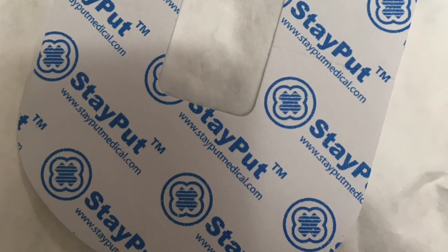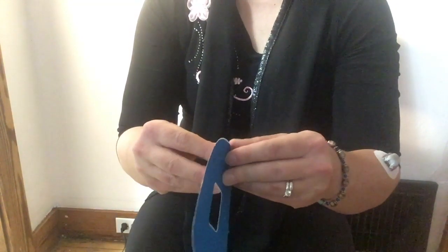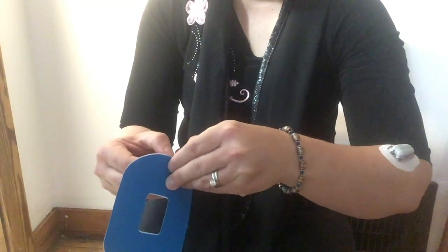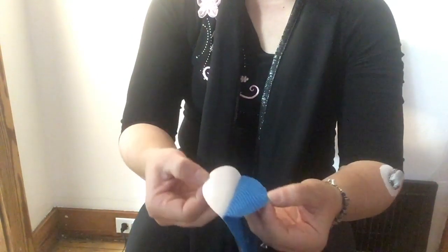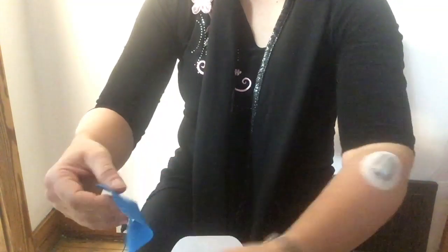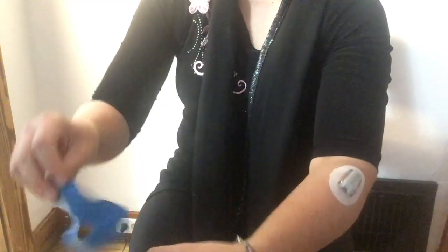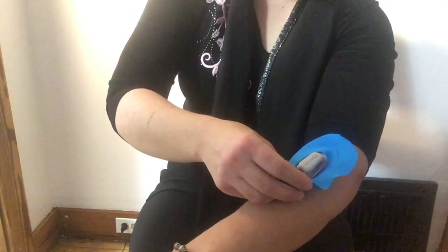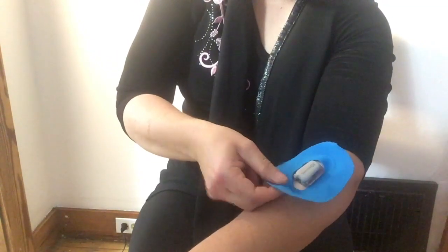All right, here we go. We're going to put the StayPut on. Let me get it. See, I have the Dexcom here on my arm. It seems fairly simple to come off the back of the sticker there. And we'll get it right over the top here.